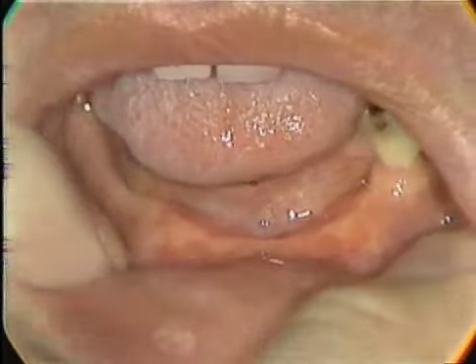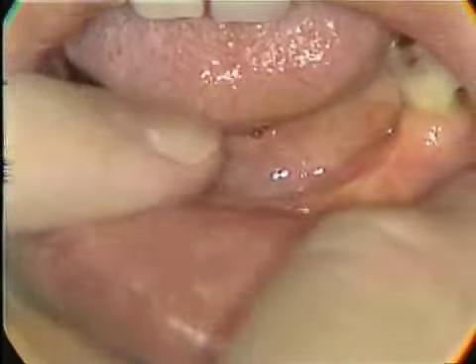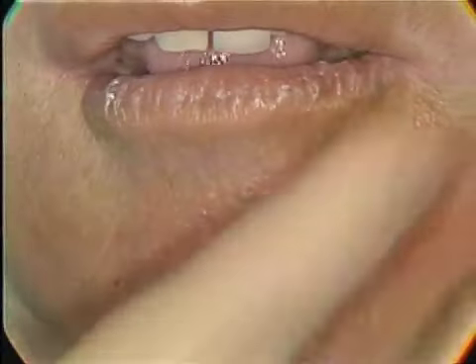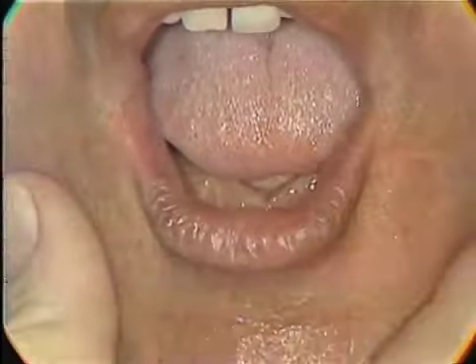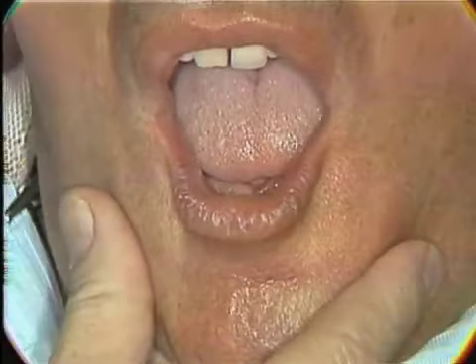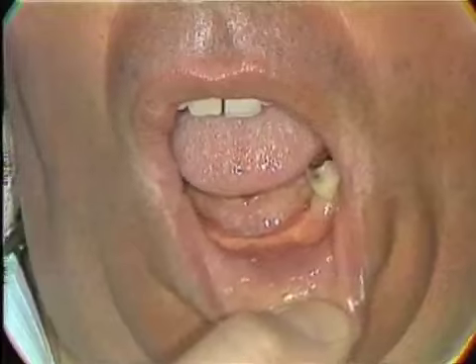around the buccal and labial areas should be at rest when the patient is functioning around this rest position. Now open wide, please. Of course, if he opens wide, this pulls the muscles and the tissue in the periphery will come up. But this isn't the position that we want to use in taking the impression, because the patient only opens wide once or twice during the day, but he functions around this neutral position.